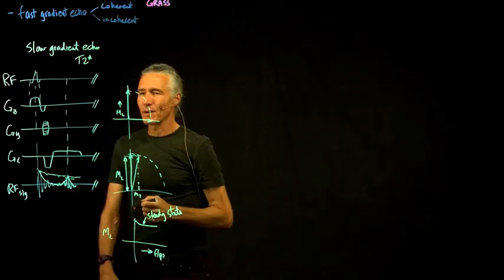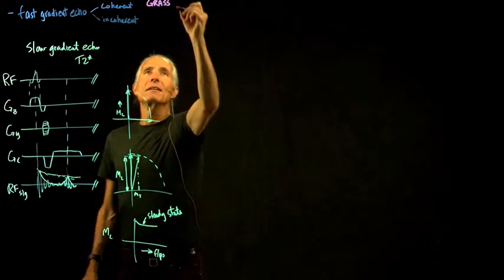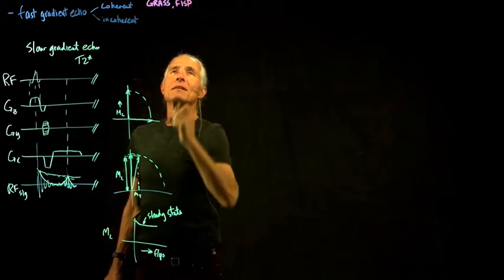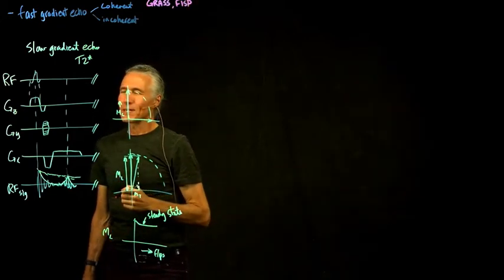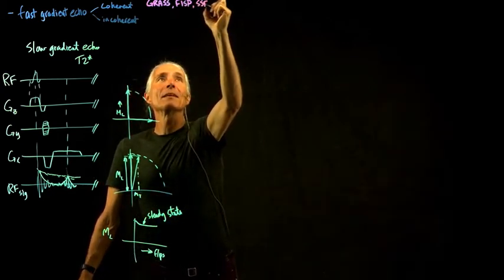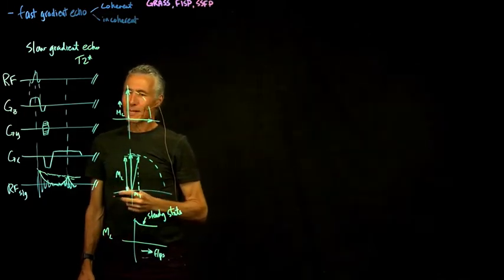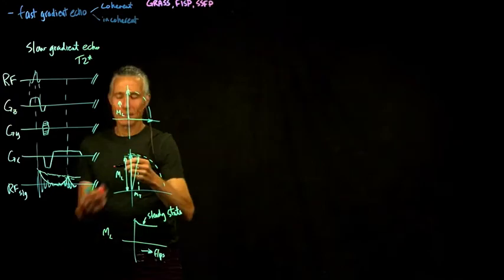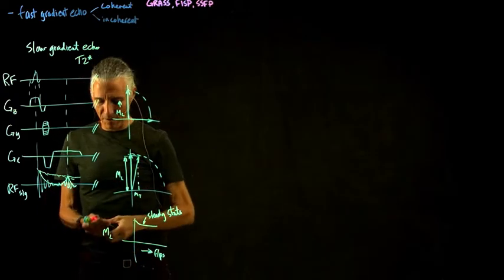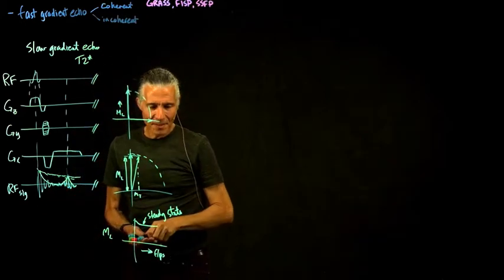That means gradient echo something in the steady state. And they're sometimes called FISP. I have no idea what that means, actually. Sometimes they're called SSFP, which means steady state free precession. Yeah, no, that's right, it's the coherent ones. Yeah, so steady state free precession.